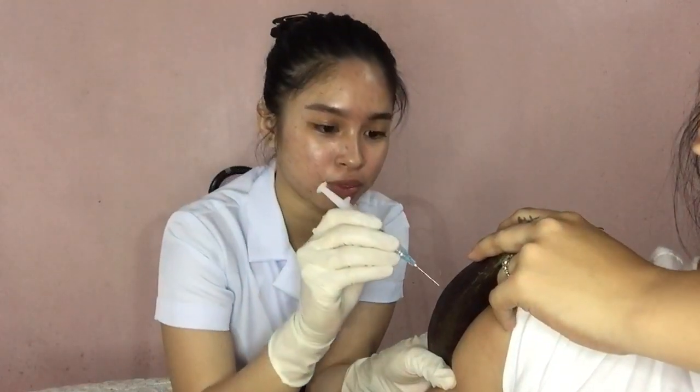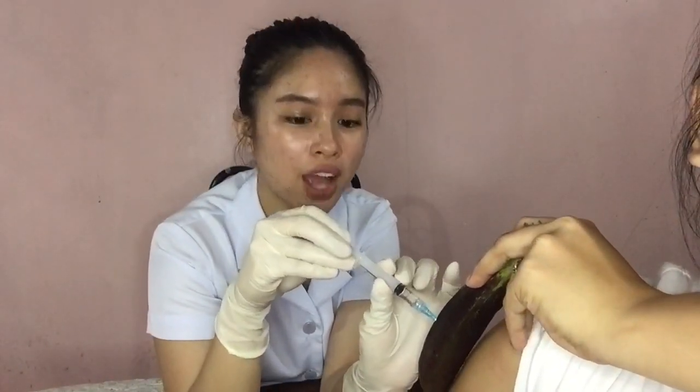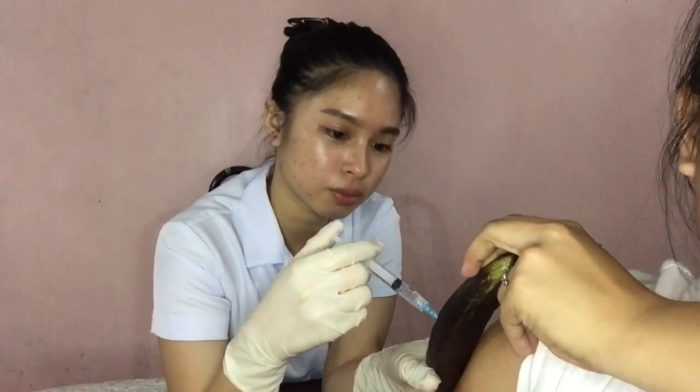Now, with your dominant hand, quickly pierce the muscle at a 90 degree angle to the skin. Continuing, pull the skin taut with your non-dominant hand. Aspirate the syringe by pulling up the plunger with your dominant hand. If blood appears, use another side and discard the syringe. If no blood appears, then proceed. Then inject the medication at 1 ml per 10 seconds. Then wait 10 seconds and slowly withdraw the needle.